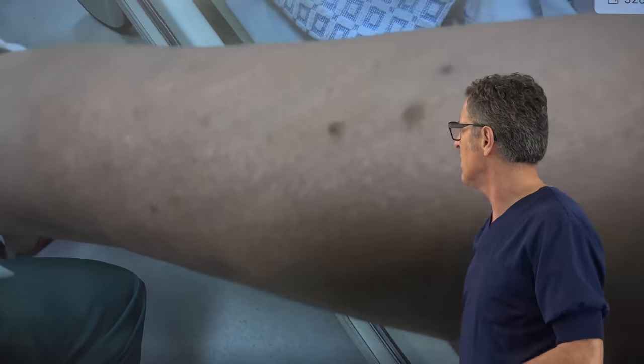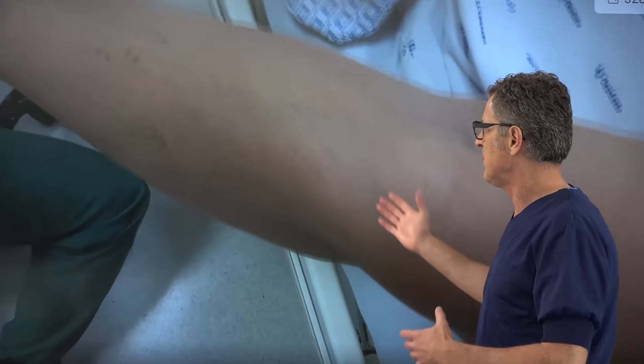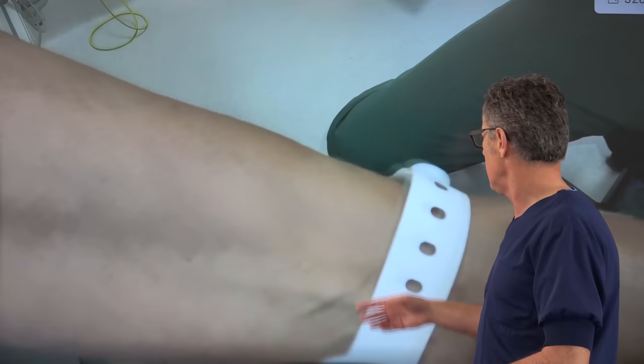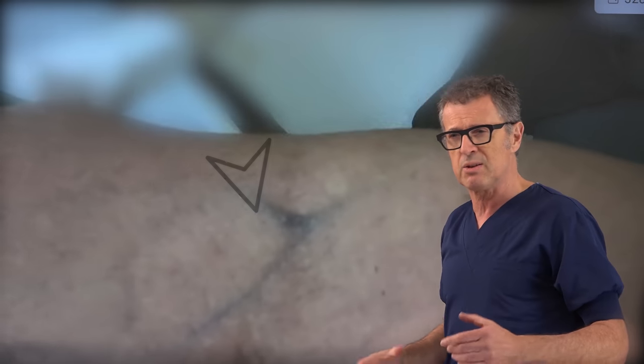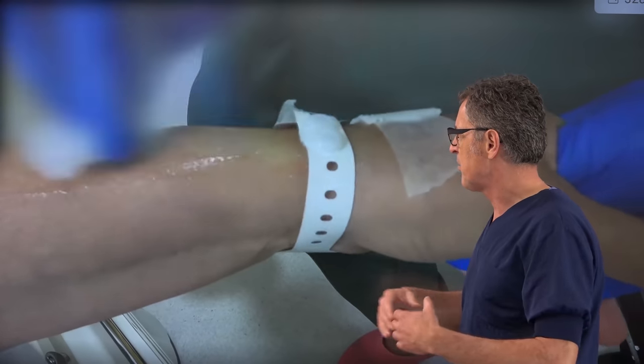We are already seeing peripheral veins appear very quickly — veins that we did not see before. They are now visible at the dorsum of the hand, on the forearm, and on the volar side of the wrist as well. So there are plenty of choices here. The simple application of a triple tourniquet gives you plenty of options.